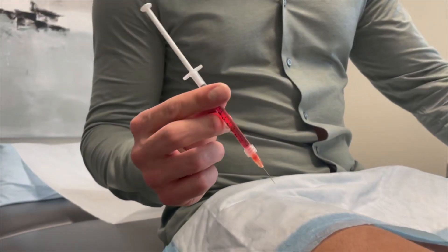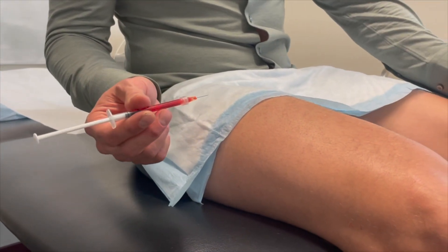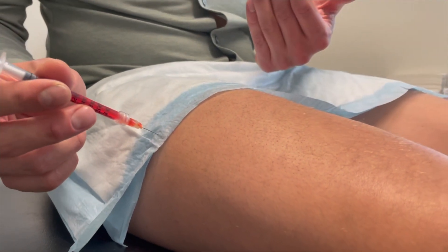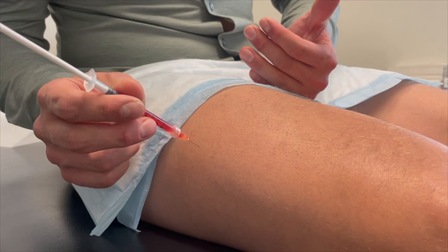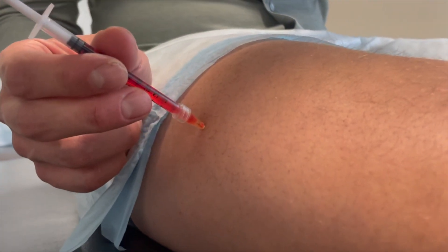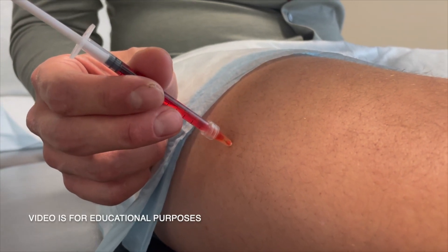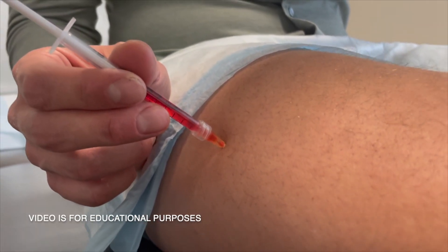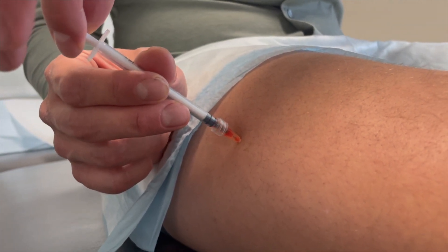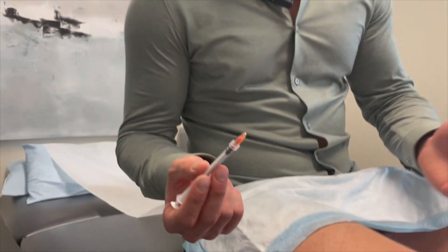Now to inject, you have to aspirate — meaning you want to make sure you're not going into a blood vessel. To make sure you're in the muscle, pull the plunger back ever so slightly after inserting. Once you have your site, push the needle straight in, then draw back ever so slightly. Make sure there's no blood. Because there's no blood, you can now inject the medication all the way into the muscle. From here, pull the needle out — and you've injected.